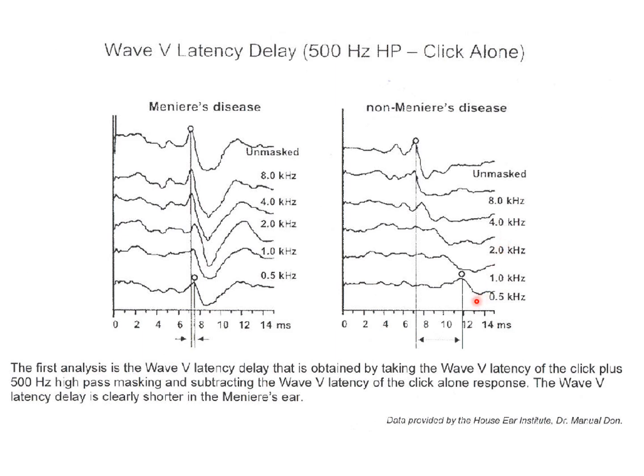And again, at this point, we focus on the last condition because it is supposed to produce the longest latency delay. So this is the ABR waveform evoked by using clicks plus high-pass noise with cutoff frequency at 0.5 thousand Hz. As you can see, the latency delay is a lot. I mean, this is normal.